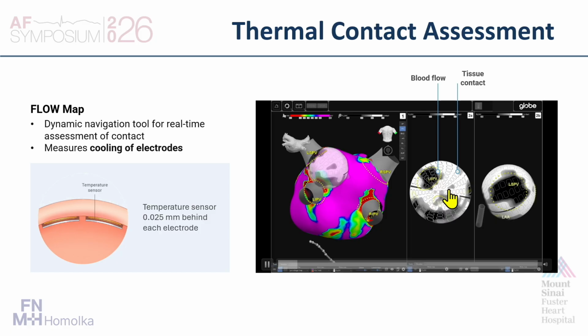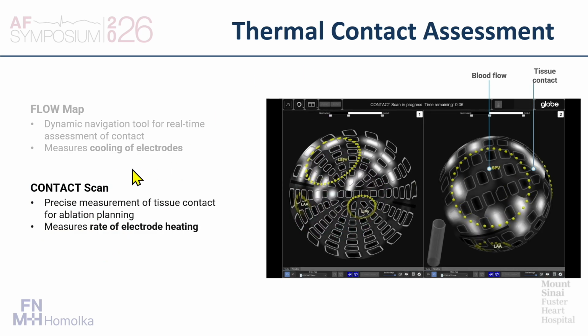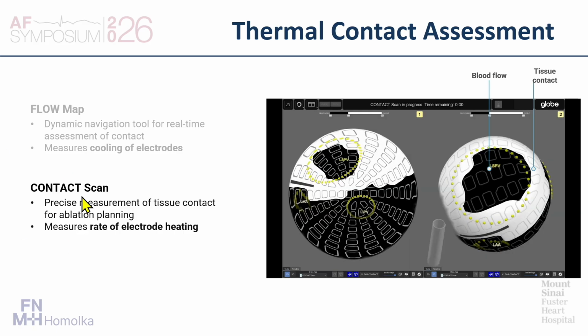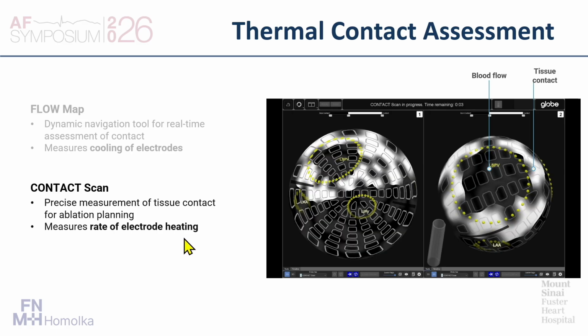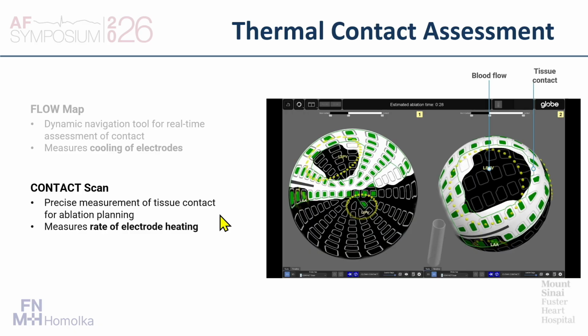Now, this is pretty good at detecting contact. It's good enough that as you're manipulating around, you can say, oh, look, I'm here at the ostium of the pulmonary vein. But if you then decide I want to deliver a lesion there, then what we want to do is do what's called the contact scan. So the flow map is a dynamic thing where you get real-time information. The contact scan uses a different strategy. It injects a small amount of energy through the electrodes to heat up the tissue, and it measures the rate of electrode heating. If you're touching tissue, the rate would be higher than if it's in the blood.